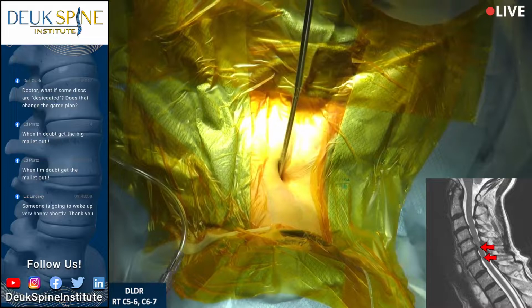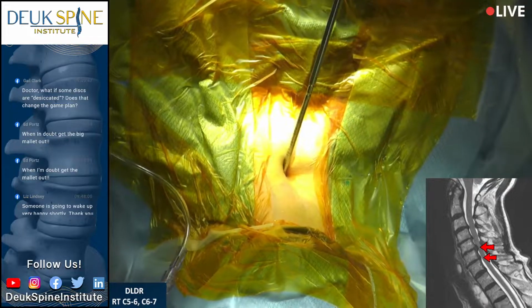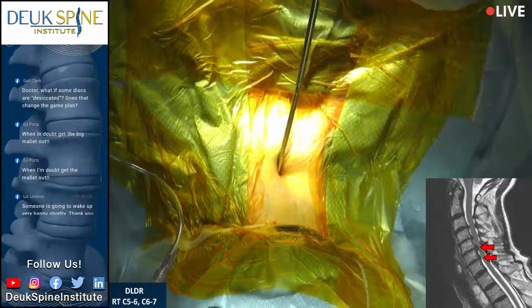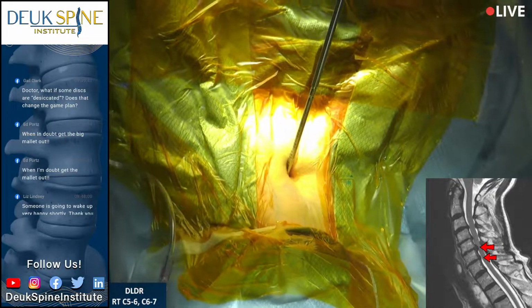Almost done, guys. Keep pulling just a little bit more. Almost there. That's nice. A little bit more, just a little bit more. I want to get another millimeter. That's probably as good as we're going to get. Good. You can all relax.